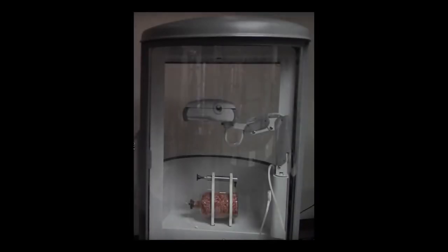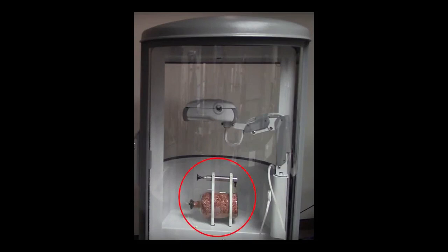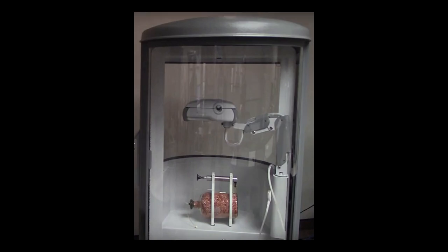While a 3-liter syringe cannot be used for measuring lung volumes via plethysmography in the Platinum Elite, an isothermal bottle from MGC with a known volume can be used in its place. Please refer to our YouTube channel to see a video on performing isothermal bottle testing.